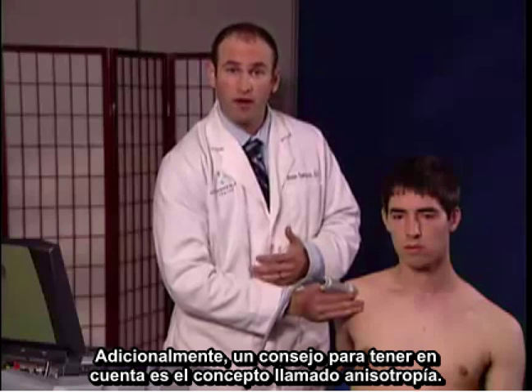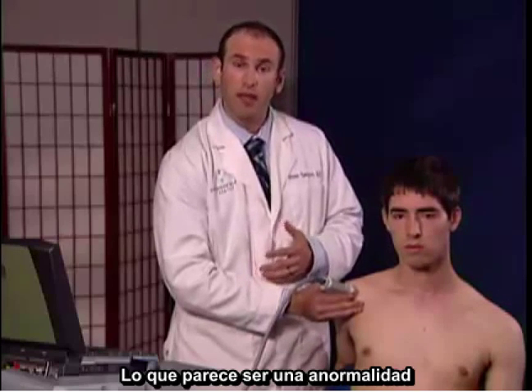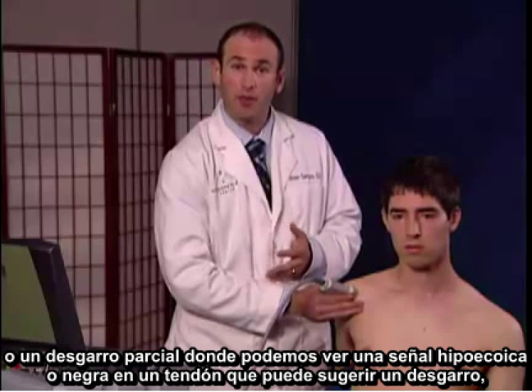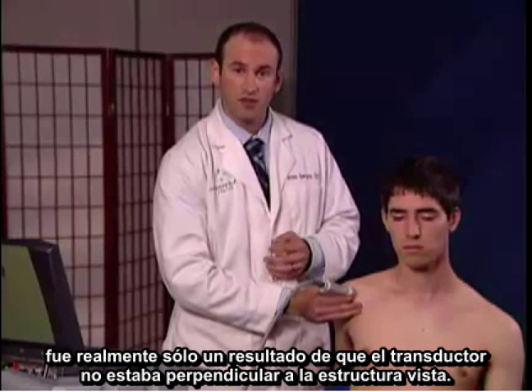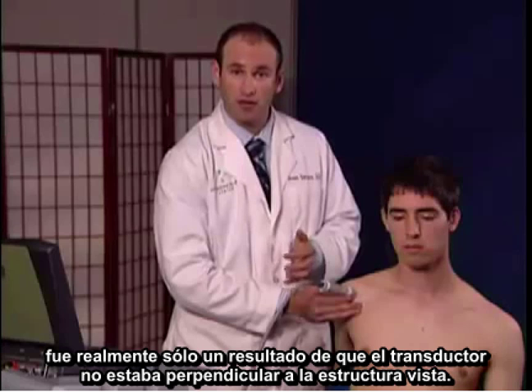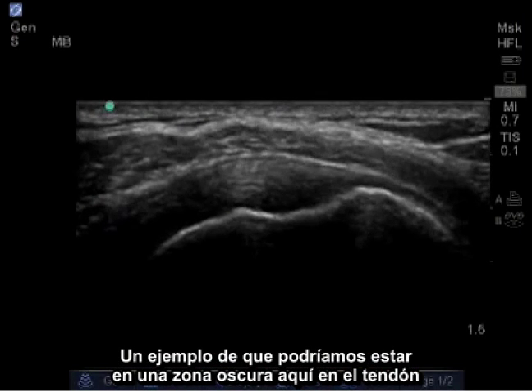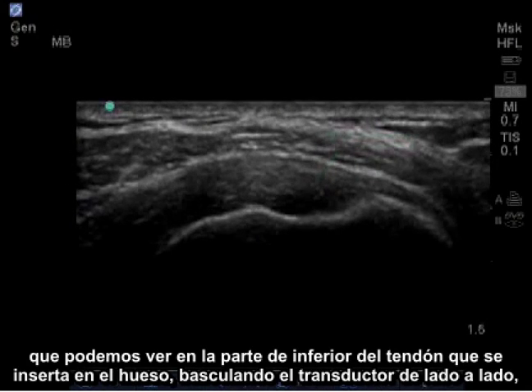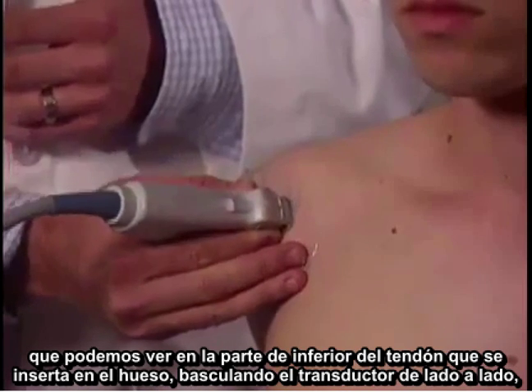One pearl to be aware of is a concept called anisotropy. What may appear to be an abnormality or a partial tear — where you can see a hypoechoic or black signal within a tendon suggesting a tear — was really just a result of your probe not being perpendicular to the structure you're viewing. An example would be blackness in the tendon on the bottom aspect as it inserts on the bone, but by rocking the probe side to side, I removed the blackness and realized that it was anisotropy.